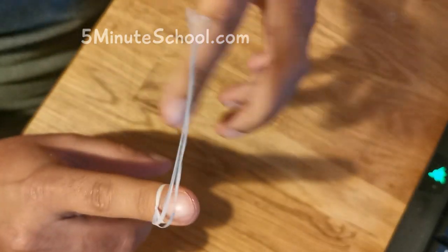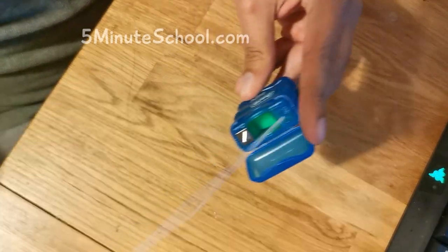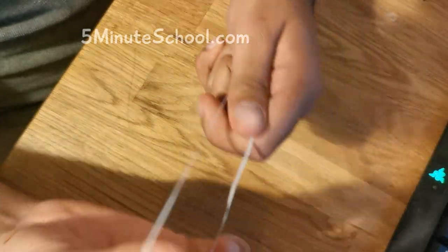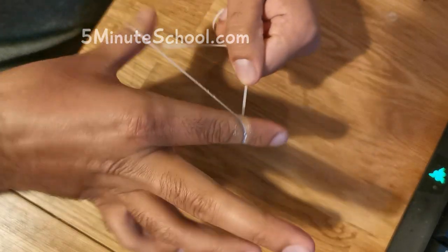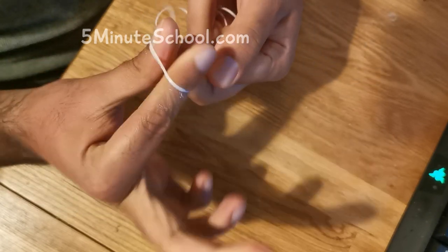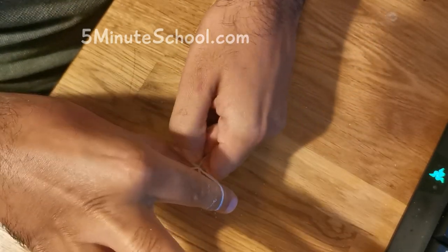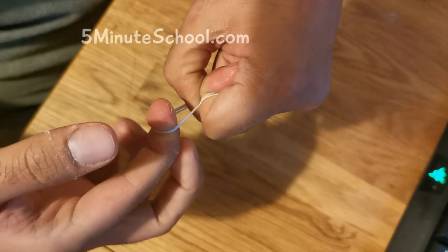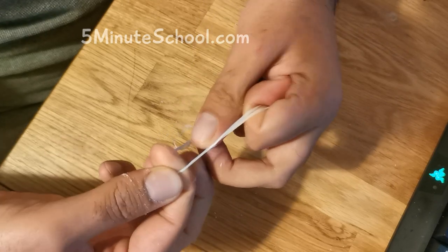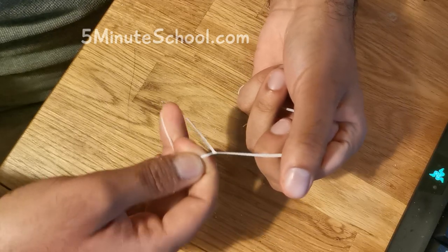The more you pull it the tighter it gets. One last time I'm going to show you guys — I'll do it in slow motion. When you get to this point you kind of want to just allow the knot to tie itself. So you just keep the area open and the knot is going to tie itself. By pulling this it causes the knot to tie.